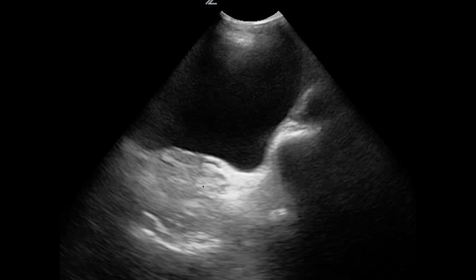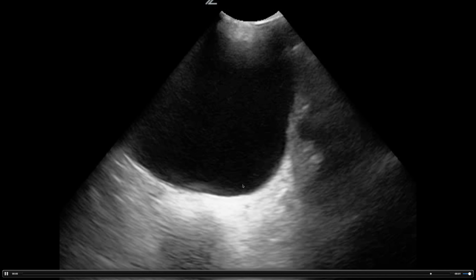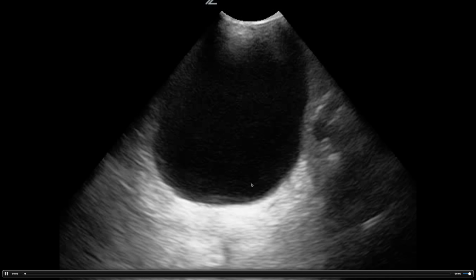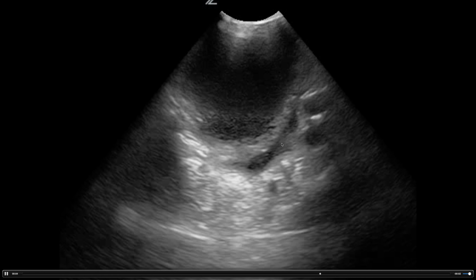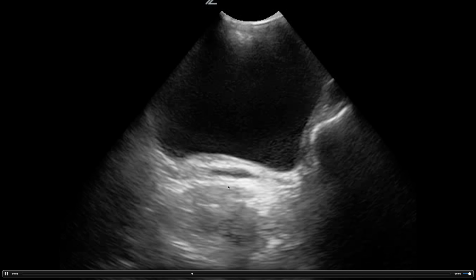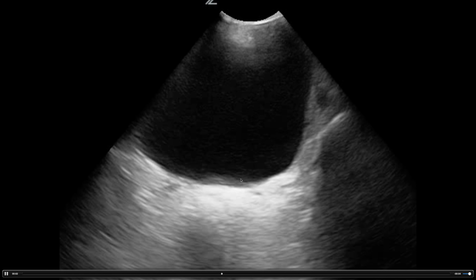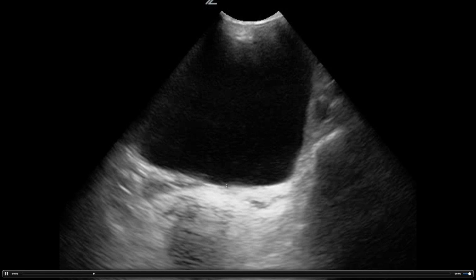A bit more subtle here. Again, fanning through quickly. Right at the end there, you see that fluid right in the back aspect of the bladder. Here it's nothing, nothing, nothing. Then boom, right there in the side. There's your sharp, delineated anechoic stripe of fluid, which again in females may be normal and physiologic. In males, you should not ever have any of that. This is a small amount of fluid, but in a trauma patient that's unstable, this is very concerning. The right situation.